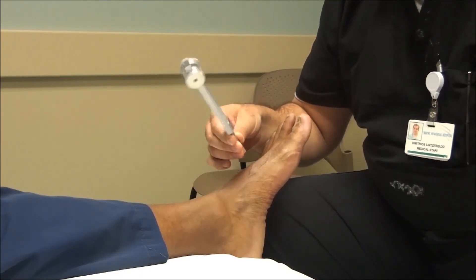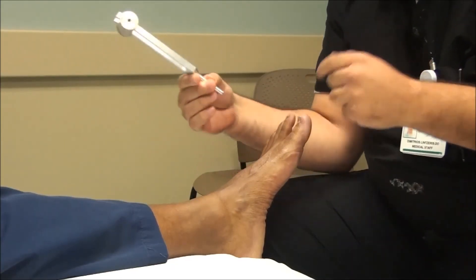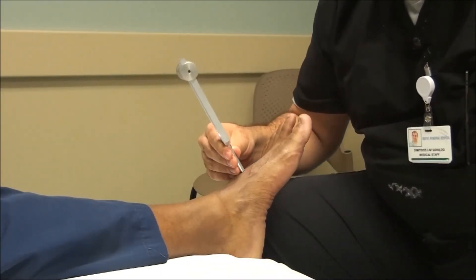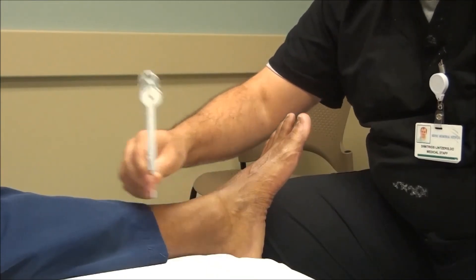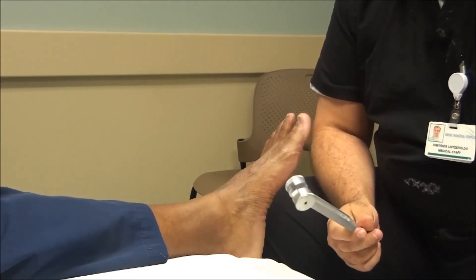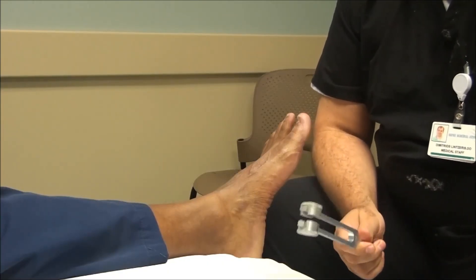You want the patient to have their eyes closed so they don't see what's happening with the test. If you find loss of vibration sensation at this particular point, the next thing you can do is move up the foot going on the dorsal surface of the foot, the malleolus, and as high up as the patella if necessary. This is a very effective, reproducible, and cost-effective test to perform to assess a patient for diabetic peripheral neuropathy.